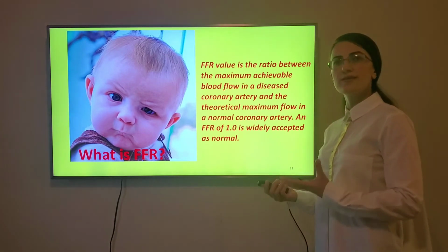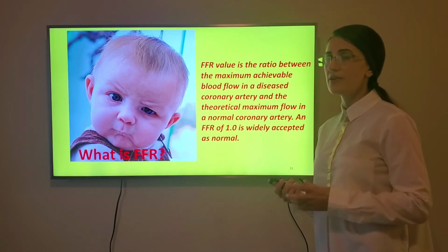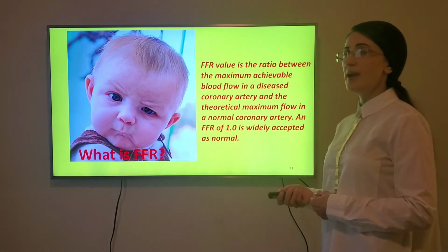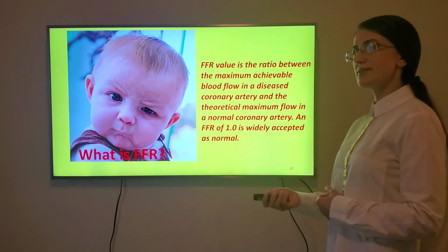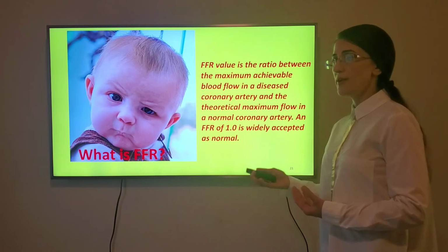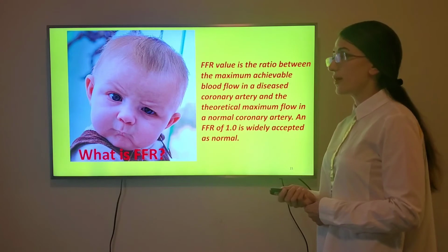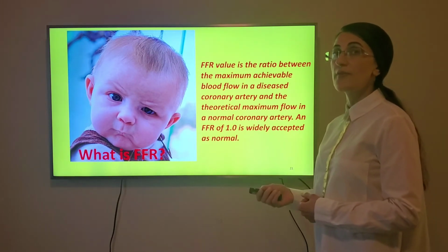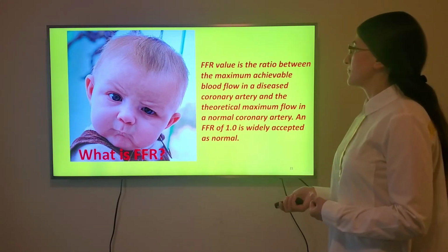Like 0.9 means there's 90% blood flow in the coronary artery, in that diseased area of the coronary arteries. When they do invasive coronary angiography, they measure FFR with an invasive method. But in Heartflow analysis, it is based on CT images, computed tomography angiography images. When they add computational fluid dynamics, they get information about FFR. Computational fluid dynamics gives the results of FFR. That's why Heartflow analysis is a non-invasive method.